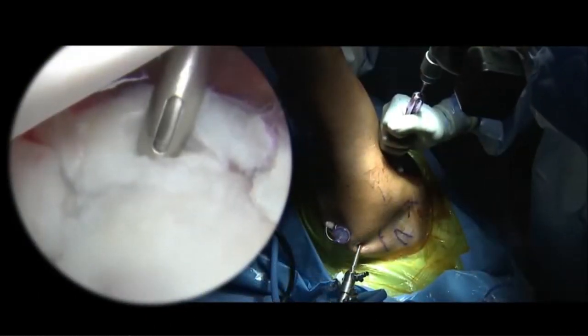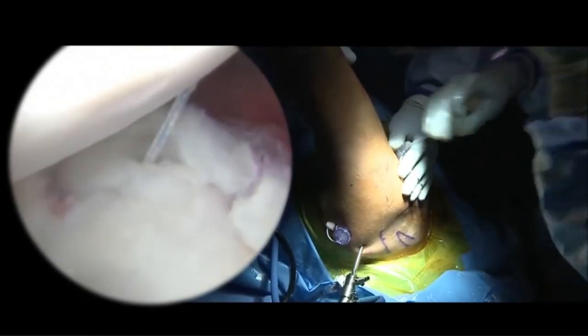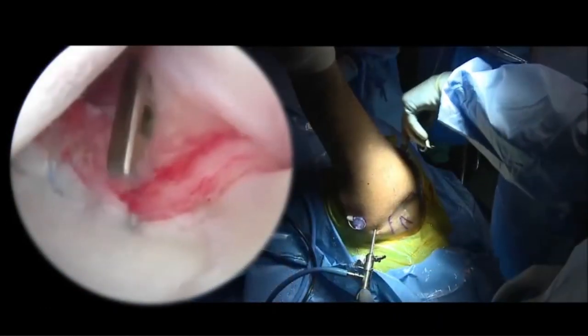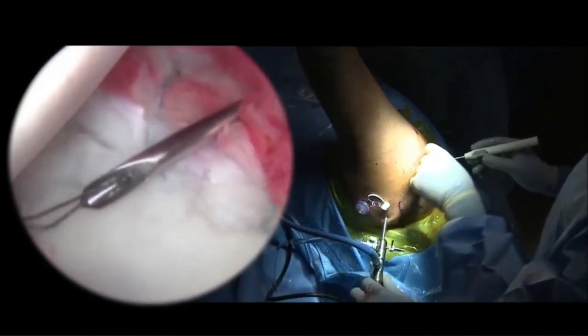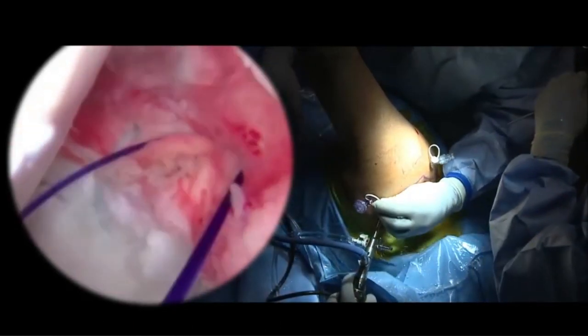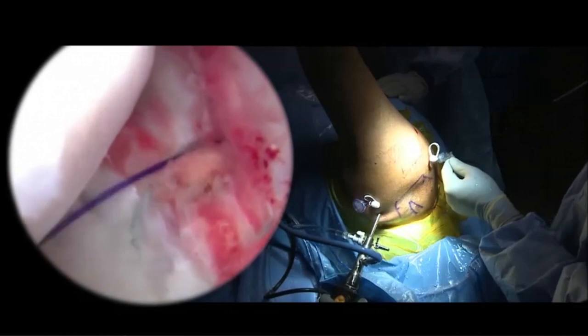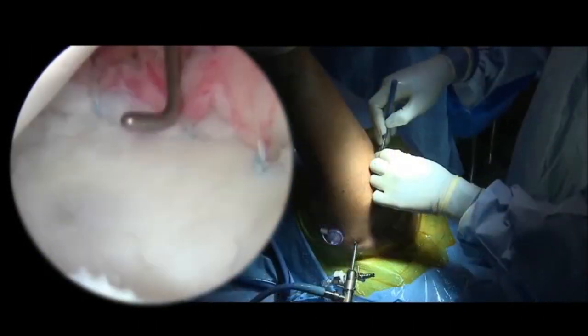Here we're placing our posterior cannula, visualizing from anterior superiorly. You can see we can get all the way down almost to the 6 o'clock position, and you can see the anterior anchor. Now we're placing our posterior inferior anchor through the guide. The guide allows us to lever the head out of the way, which really facilitates getting the anchor positioned where you want it. We then use a crescent lasso, which allows you to take a large bite of the capsule. Here you can see the completed repair. We then close the posterior portal using a number one PDS suture through the crescent lasso and a 22-degree bird beak through the capsule, providing additional stability. Here you can see the completed repair with excellent tension in the inferior and middle glenohumeral ligament complex, with anchors circumferentially around the whole area of damage.